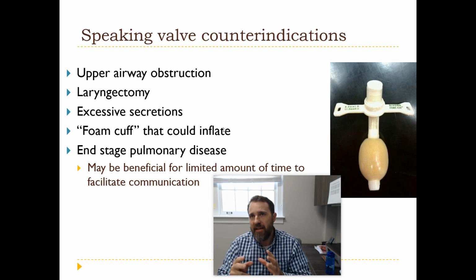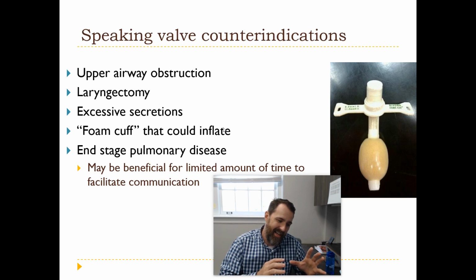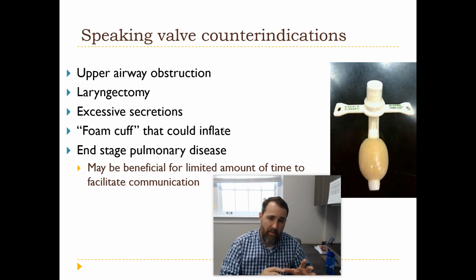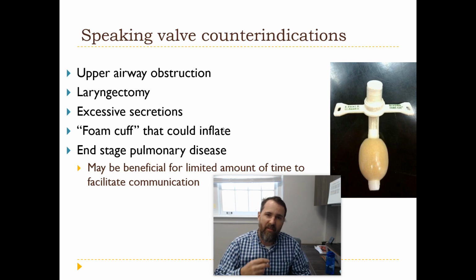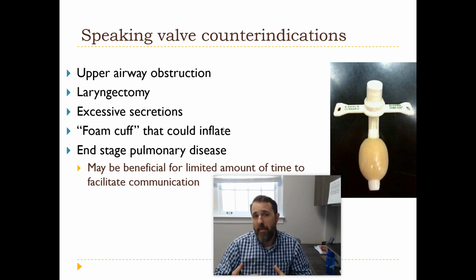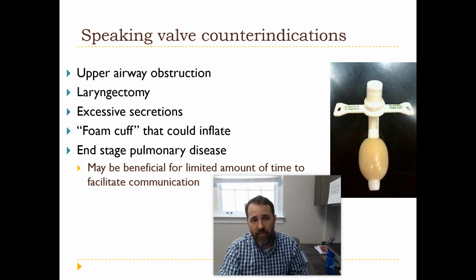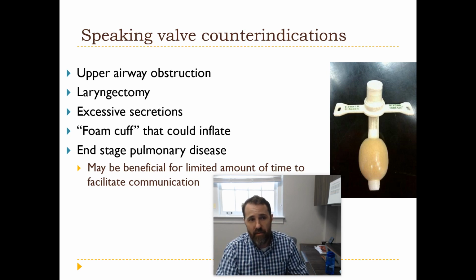But it is nice that even if it does fatigue the patient that is at a late stage in their respiratory illness, they can take the speaking valve and place it for a period of time and be able to speak for a period of time. So for instance, when they have visitors, and then when the visitors leave, they could take the speaking valve off and not have to worry about it.